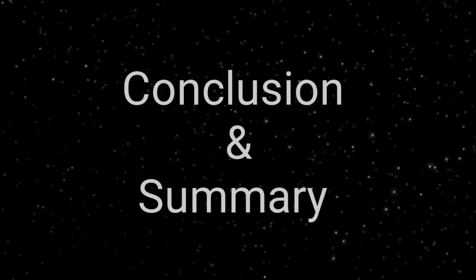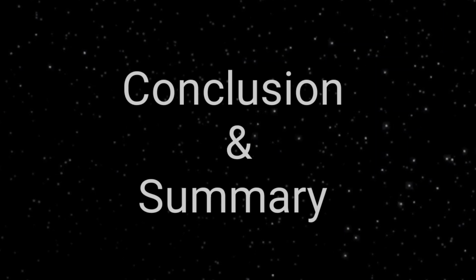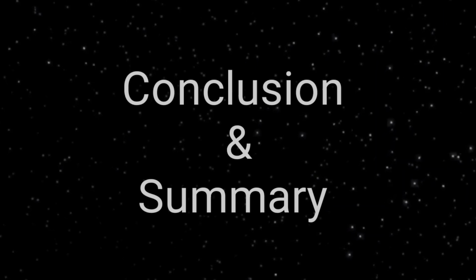It's quite easy to diagnose on the images if you know all the pathology about it, and if you have seen all the cases before, so it will no longer be difficult for you. So this was all about the parasellar meningioma.